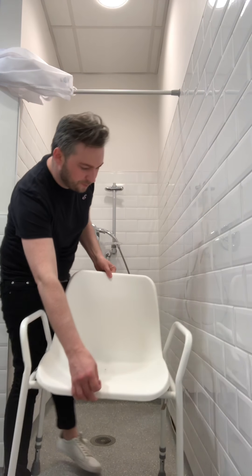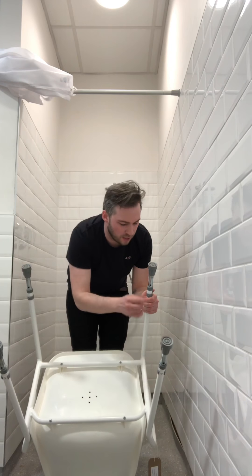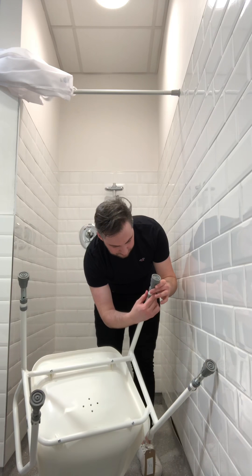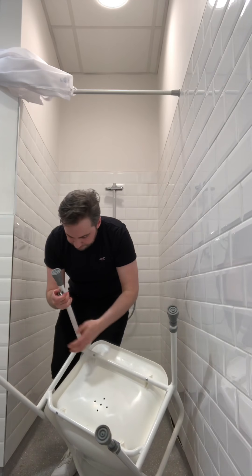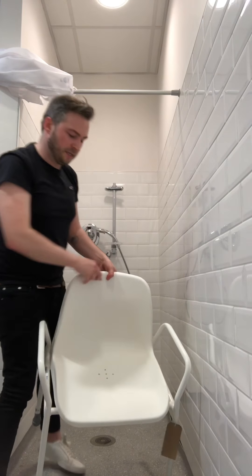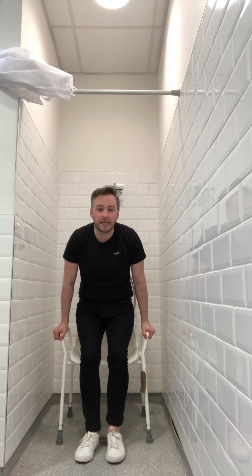Like with any other chair, you need to make sure the height of the shower chair is correct for you — and this can be adapted. The four legs have extendable sections: you release the clip and then lower the pin. Make sure you lower all the legs to the same length, so that your transfer is safe and you're not on an uneven surface. You could ask a family member, a carer, or your occupational therapist to help with that. Once seated, your feet should be firmly on the ground — not dangling or pointing. If your feet are dangling, the chair is too high and needs to be lowered.